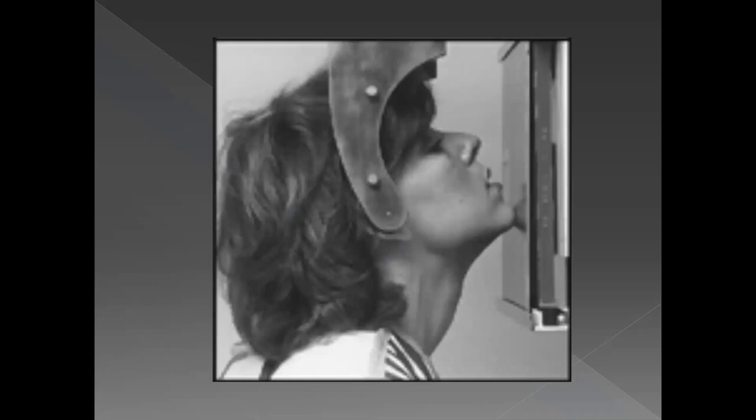All right, so you can see this is the patient positioning for an occipitomental projection. It is similar to the one that was taken for the 0 and 30-degree OM projection. The only difference here now will be that the X-ray beam, which is located over here, that will be making a 37-degree angulation with the floor. All right, so instead of 30, now it's changed upwards by another 7 degrees. So now it's a 37-degree OM projection, and that is how this X-ray will be taken.